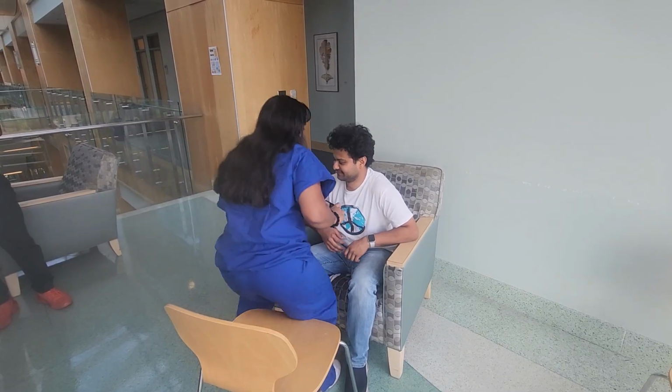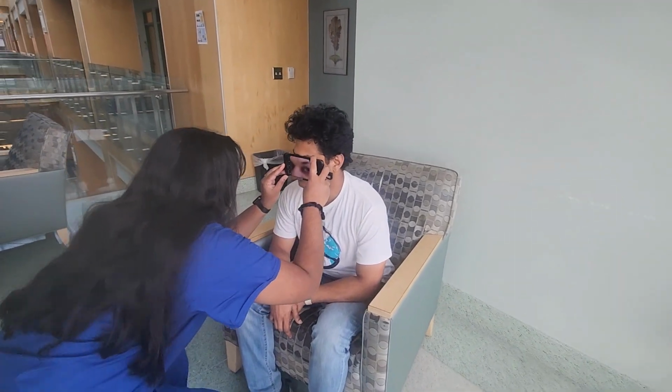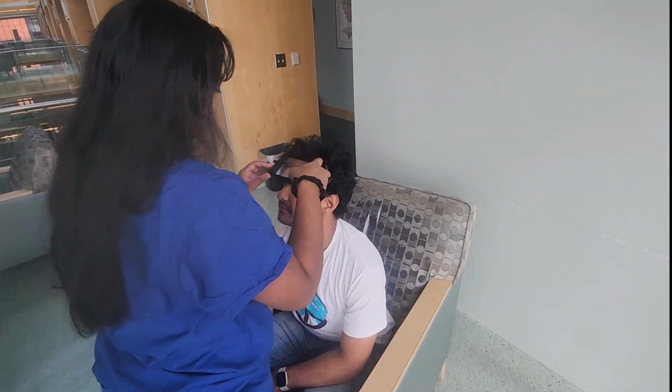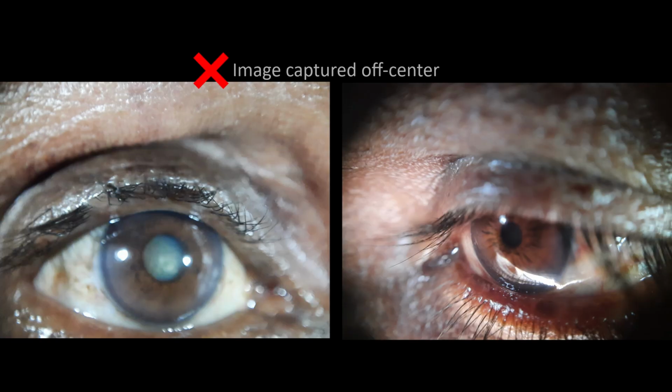Make sure you are at eye level with the patient by sitting across from them or bending to their level. If you aren't taking pictures at the same height as the patient, your photos will show the eye located off-center within the image. This problem makes it more difficult for the doctor to get a clear view of the eye and correctly diagnose the patient's condition.